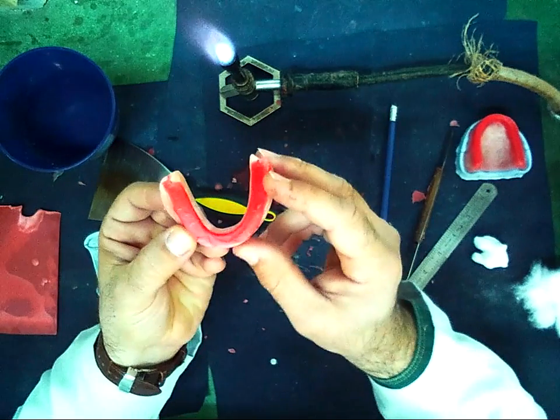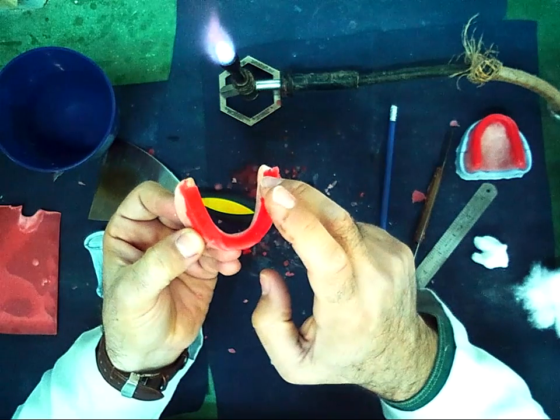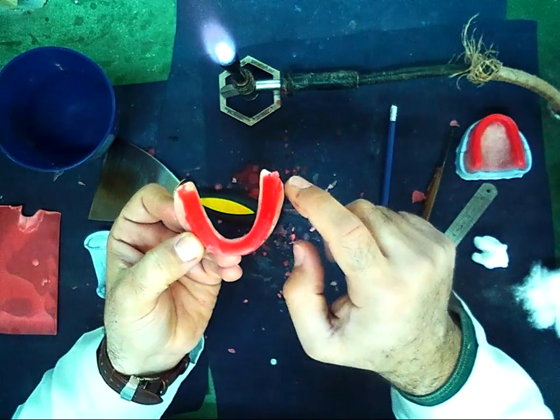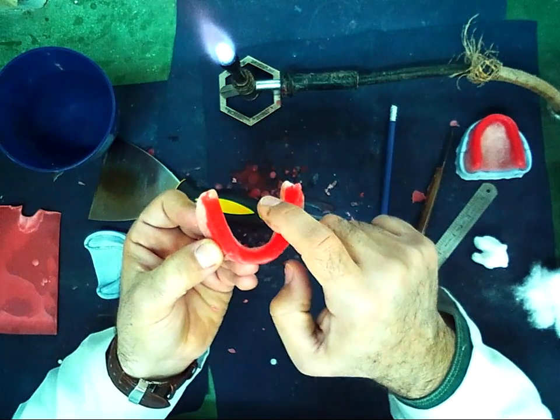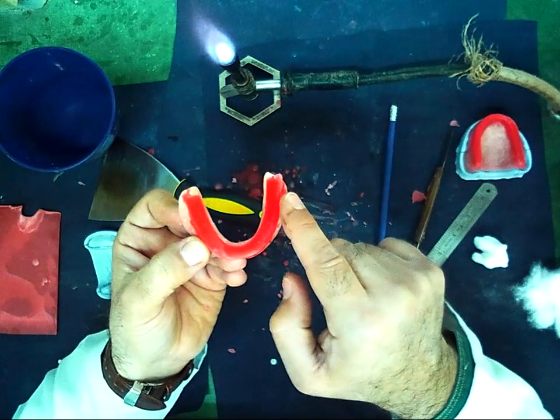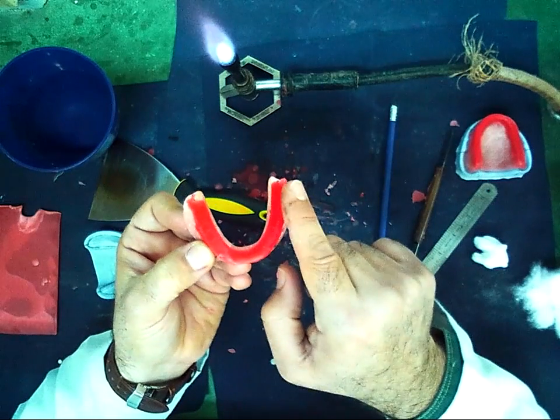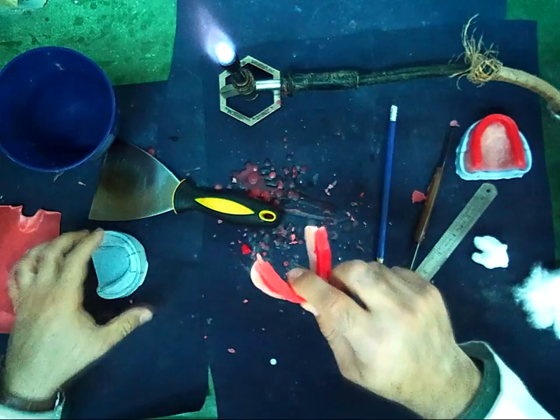The width of the wax should be anteriorly, as the upper, 4 mm and posteriorly 7 mm. And again, if I want to take from the width, I should take from the buccal and lingual to keep the line in the middle. Not in one side I take, from both sides, to keep the line in the middle, to keep the wax on the crest of the alveolar ridge.